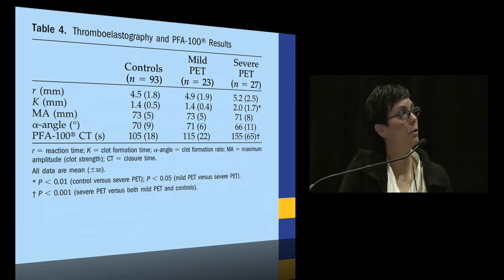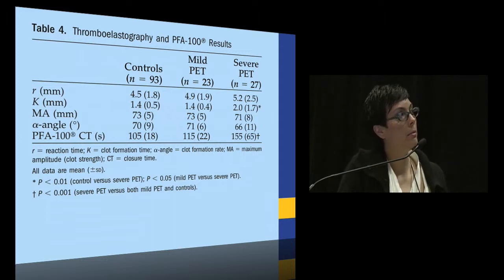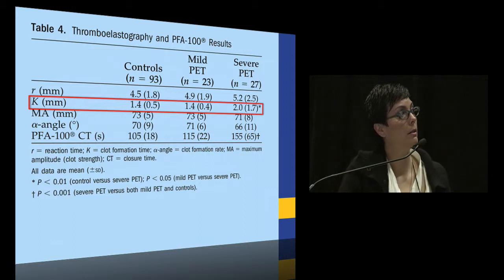And then just to show you here, the K, which just to remind you, is the clot formation time. Not really much difference between the controls and the mild preeclamptics, essentially the same, but a significant difference when you compare these groups with the severe preeclamptics.